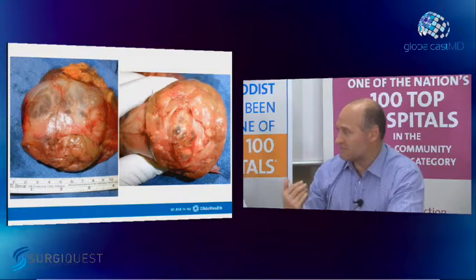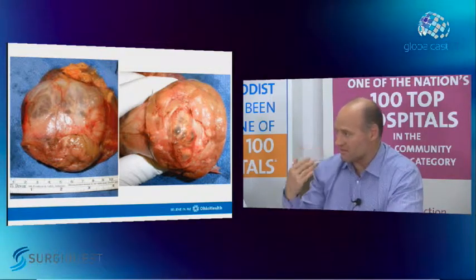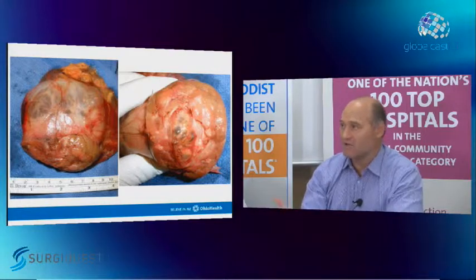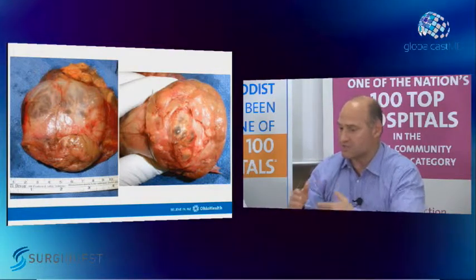You're not handling it during that critical part, so it's almost like a pheochromocytoma mindset. You're trying to operate away from that. The other thing with a cystic tumor is you need a thicker margin of normal renal parenchyma, because that's where you're going to be putting your pressure.